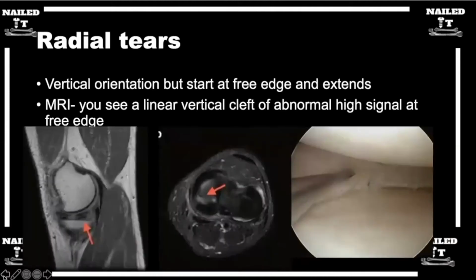Getting the difference between a horizontal tear and a radial tear. What are some of the things that clue us into this is a radial tear, not a horizontal tear, on MRI? Yeah, so for instance, if you look at a sagittal image, your radial tear or a parrot beak type tear out to the periphery, if you think about the plane that's going in, that tear is more in the coronal plane. So you're going to see that on a sagittal image as a vertical white line, right? You're going to see it more in the central aspect of the meniscus as opposed to a vertical line in the periphery at the meniscocapsular junction of a longitudinal vertical tear.